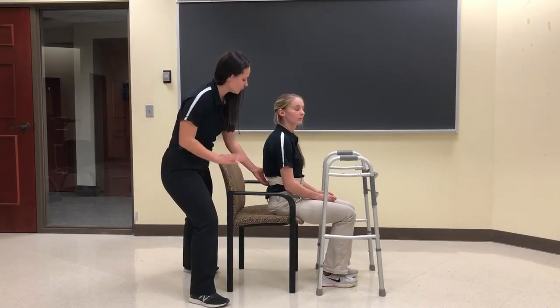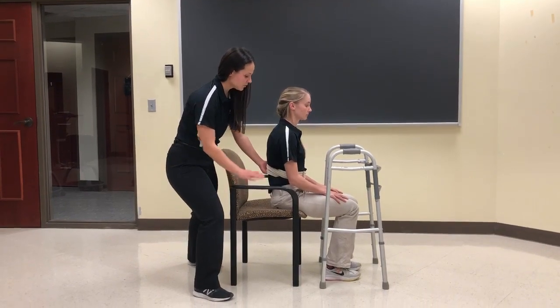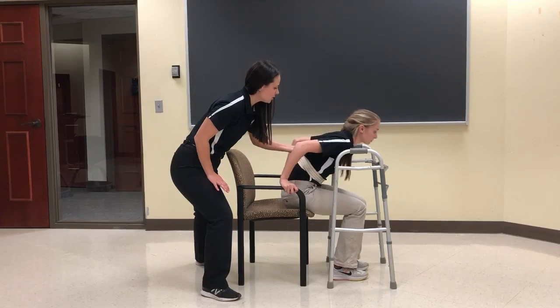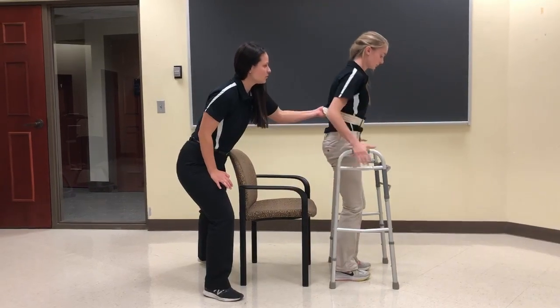Okay, Caitlin, are you ready? All right, I'm going to be holding you back here for support. First, I want you to put your hands on the armrest of the chair and push straight down and lean forward. Swing your hips forward, extend them, and then reach for the walker.